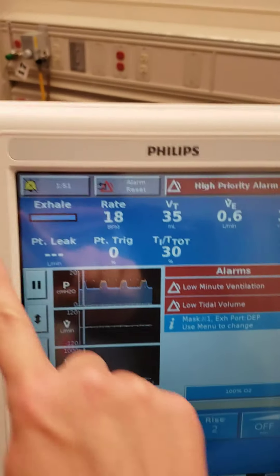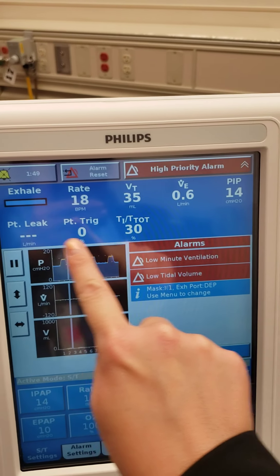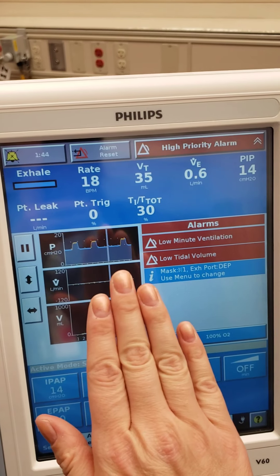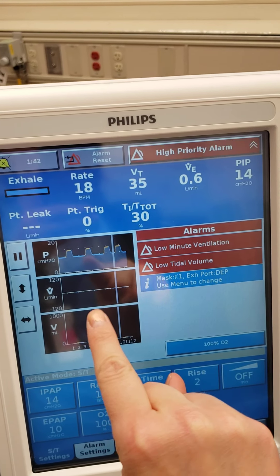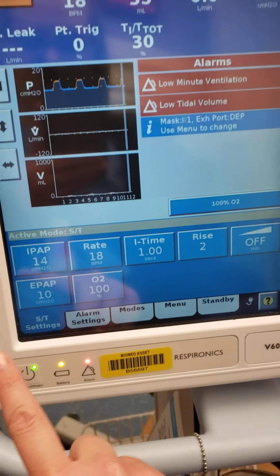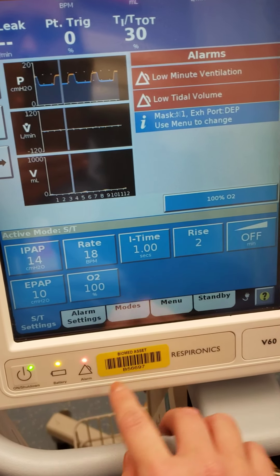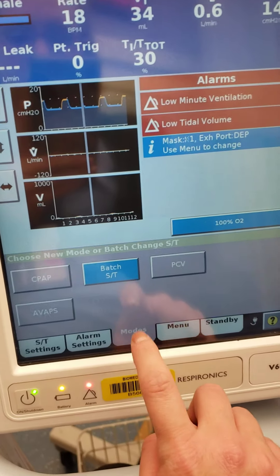So this is what the patient is doing — what you're reading of your patient. These are different waveforms. And then down here are the settings you put in. We talked about the settings already, but I do want to talk about modes.